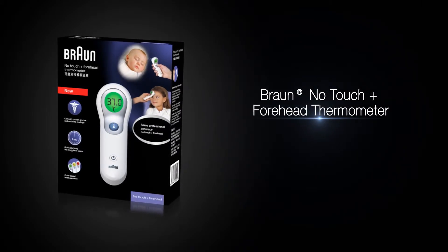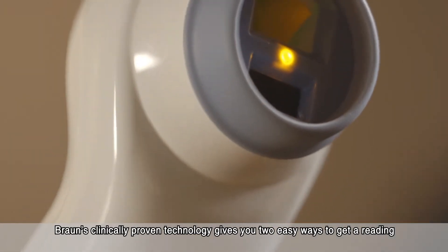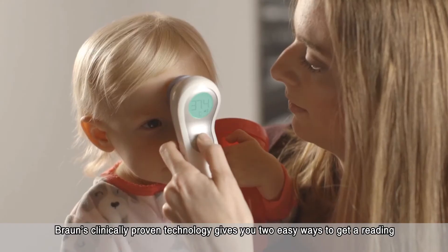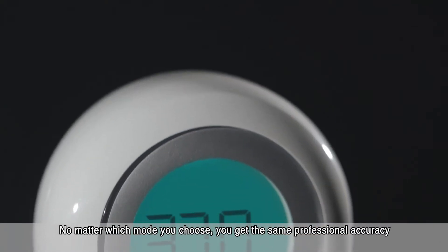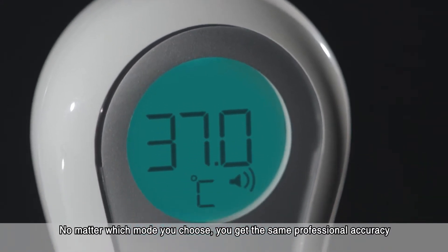Meet the Braun No Touch Plus Forehead Thermometer. Braun's clinically proven technology gives you two easy ways to get a reading: with a touch of the forehead or no touch at all. No matter which mode you choose, you get the same professional accuracy.